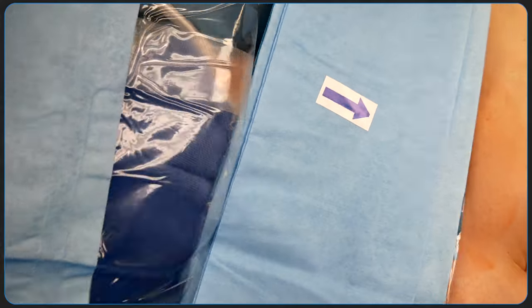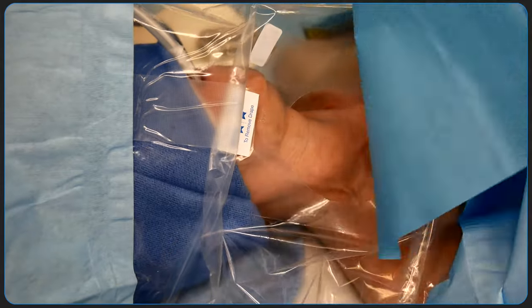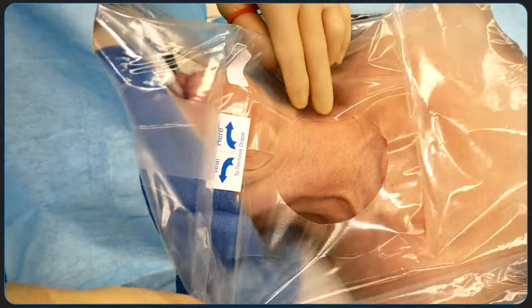After a wide prep of the patient's neck, sterile drapes are placed with the fenestration overlying the target anatomy.